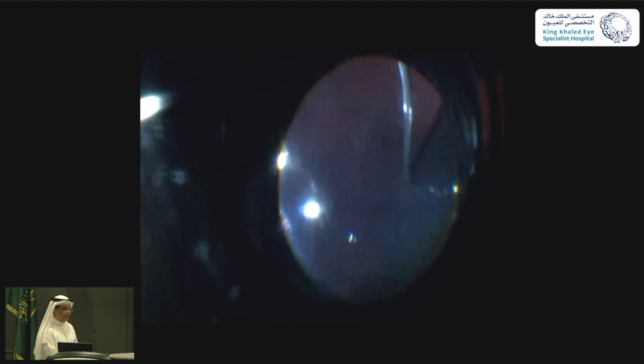Now, after the end of the procedure, they will take the bulk of the vitreous to allow space for the intraocular tamponade. Now, if you note, there is cryo, and the cryo scar is there. See the effect of the cryo? And in some of the cases they treated with endolaser.